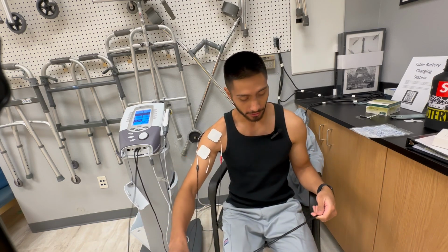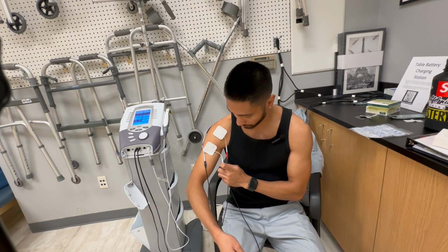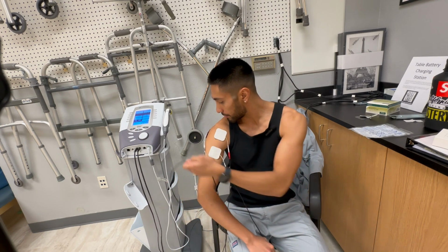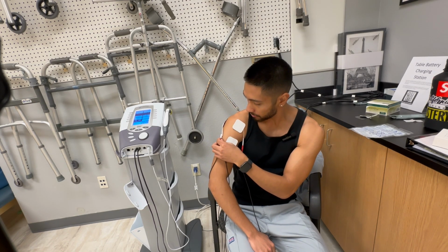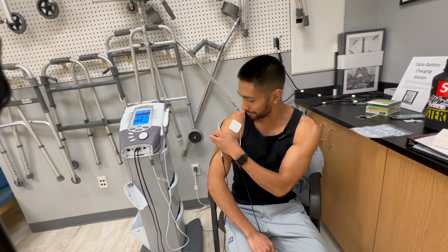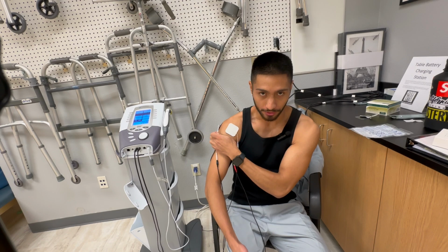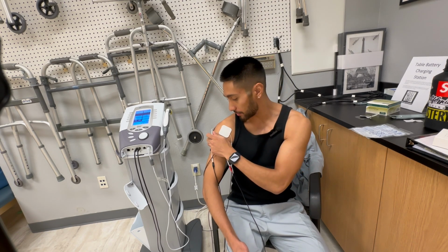This is important for IFC. And anytime, its channels will always cross. That's the channel goes there. And the last channel. Get it. If I can get it. It's kind of hard when it's yourself, obviously. It's easier when it's the patient helping them set it up.